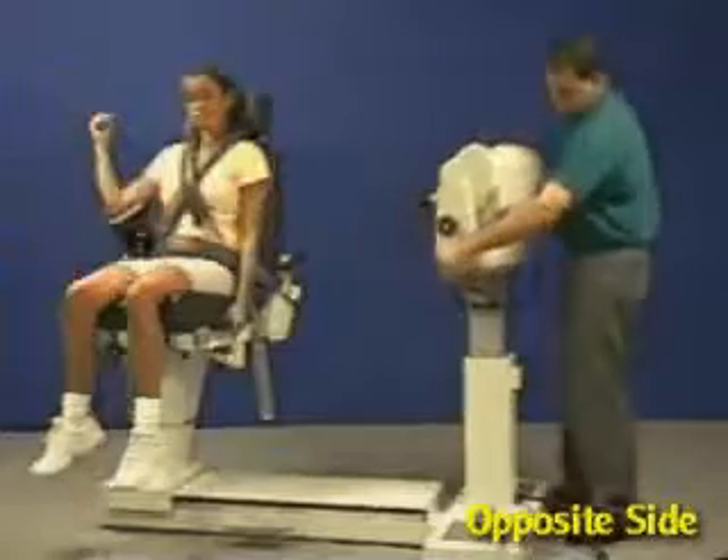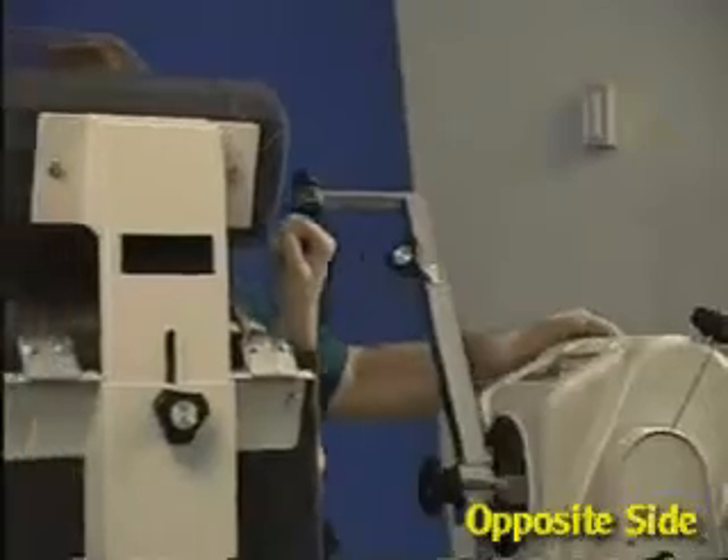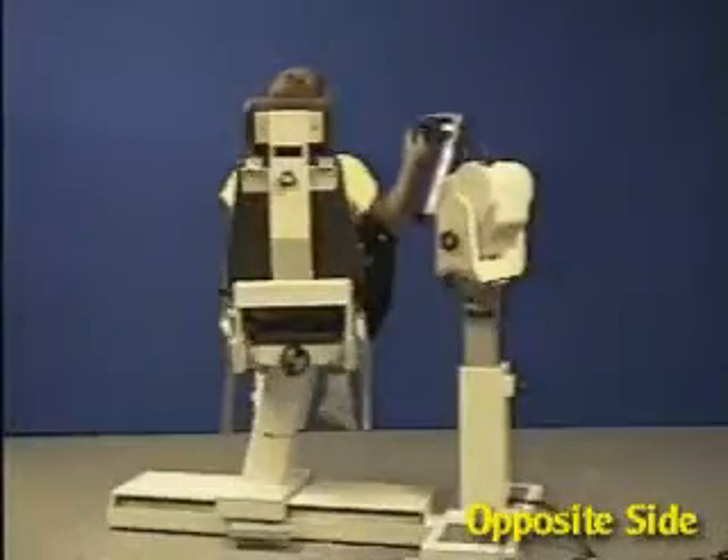Rotate dynamometer and chair to opposite 15 degree setting. Move patient into position and check range of motion stops.